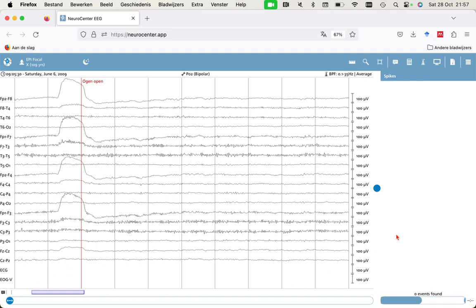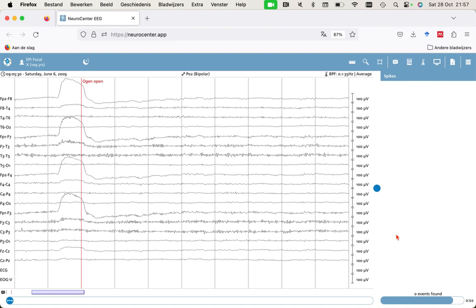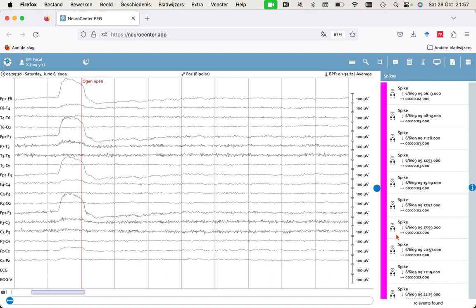It's starting up now and it takes about, I think, 10 seconds for a routine EEG of between 20 to 30 minutes to detect if any epileptiform discharges are present. It's ongoing now. There are a few seconds left, and then the detected events will be shown on the right.